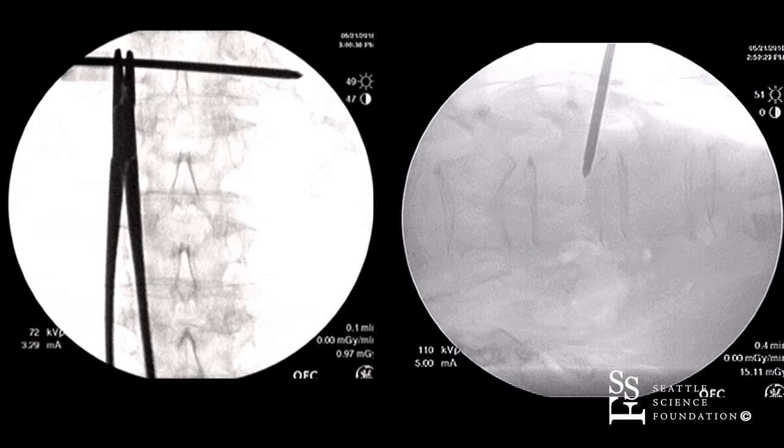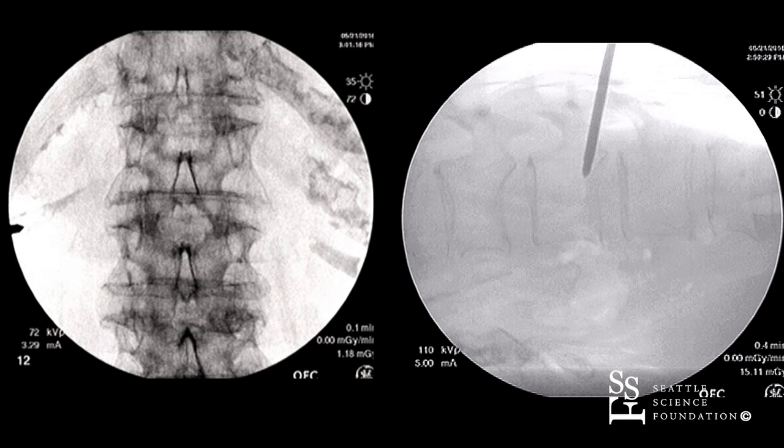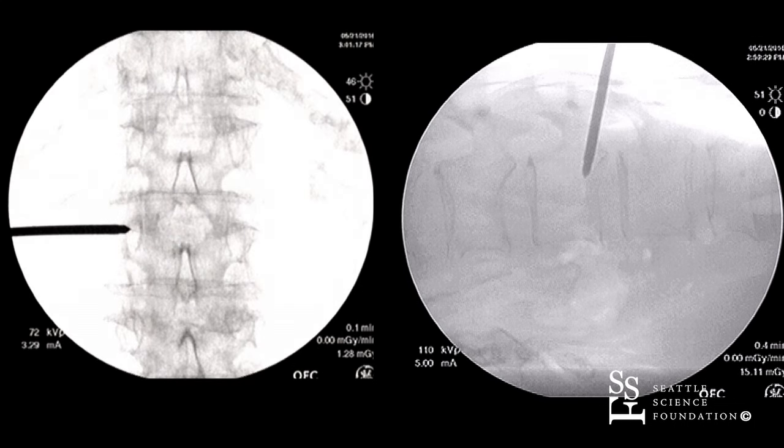We're looking at getting at the L2 vertebral body. As you can see, the L2 level is not sharpened at this point. So let's go a little bit of cranial tilt.